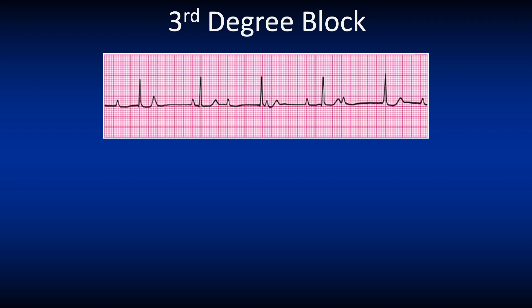Here is another example of a third degree block, but this is not typically what we associate with a third degree block, as the QRS complex is narrow. The QRS will be narrow when the block is above the His junction. Don't get confused when the QRS is narrow, as this ECG still meets all the criteria to be classified as a third degree block.